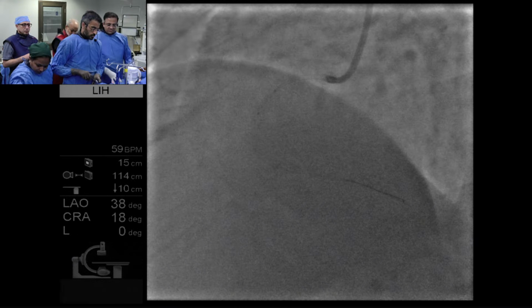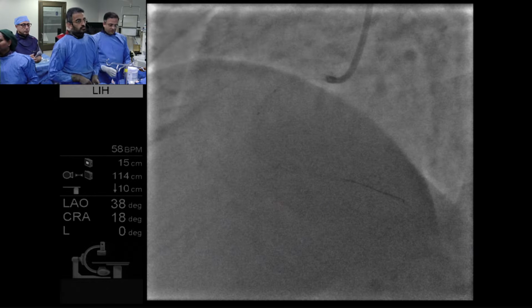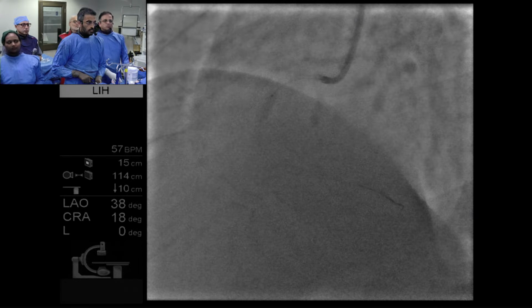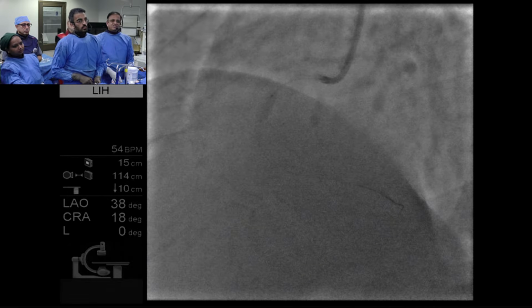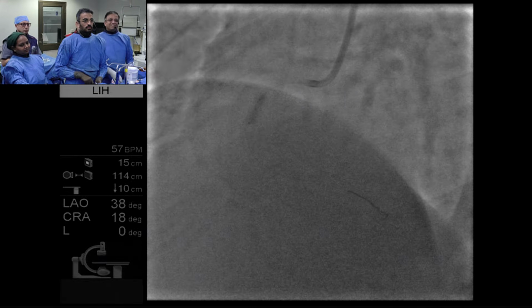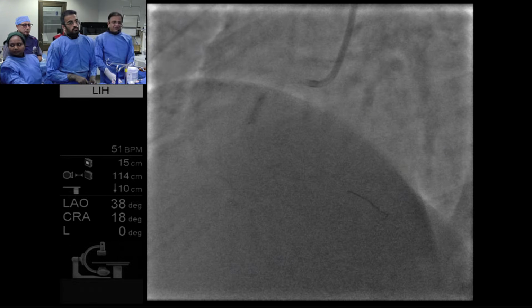And again, the first 6 atmospheres are painful because we have to go up one every 5 seconds. I normally look at the heart rate, and if it is luckily 60, then I count 5 beats. It's a royal pain, but it is a very good device. I have to say, Wolverine is different from other scoring balloons. Definitely different, even though it's classified with other similar scoring balloons.